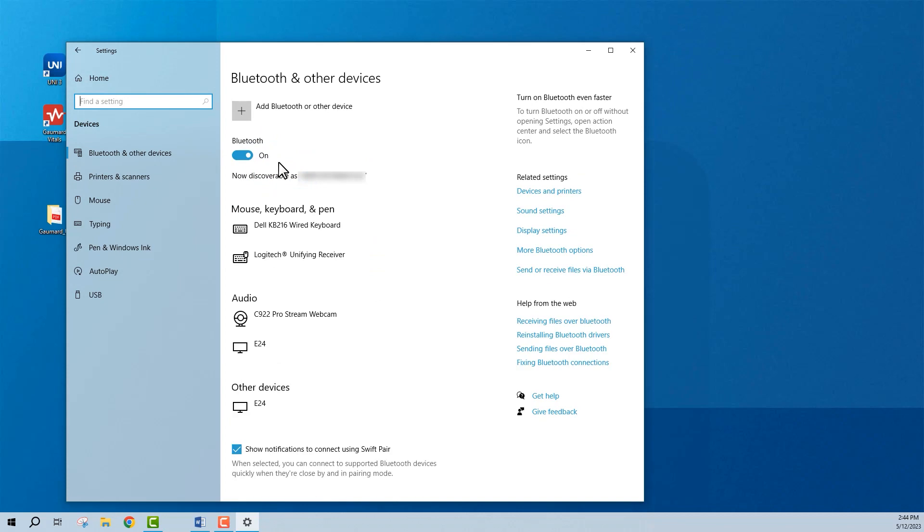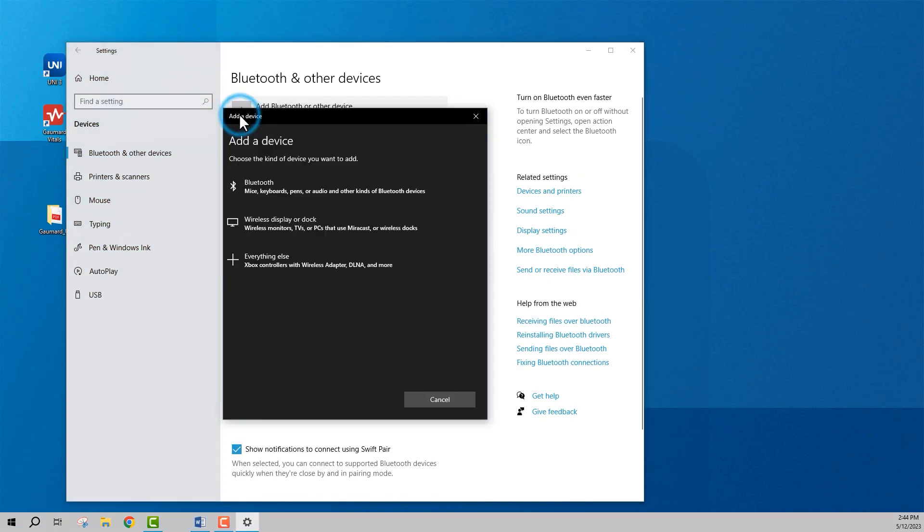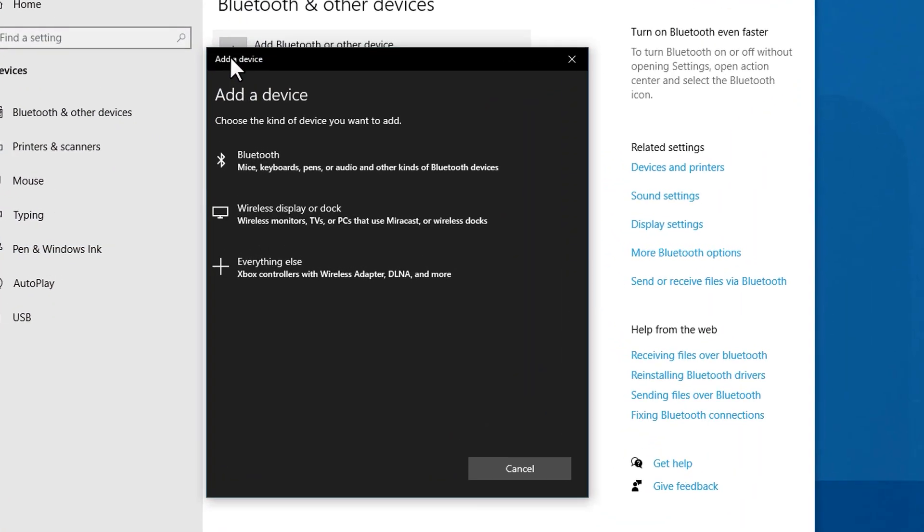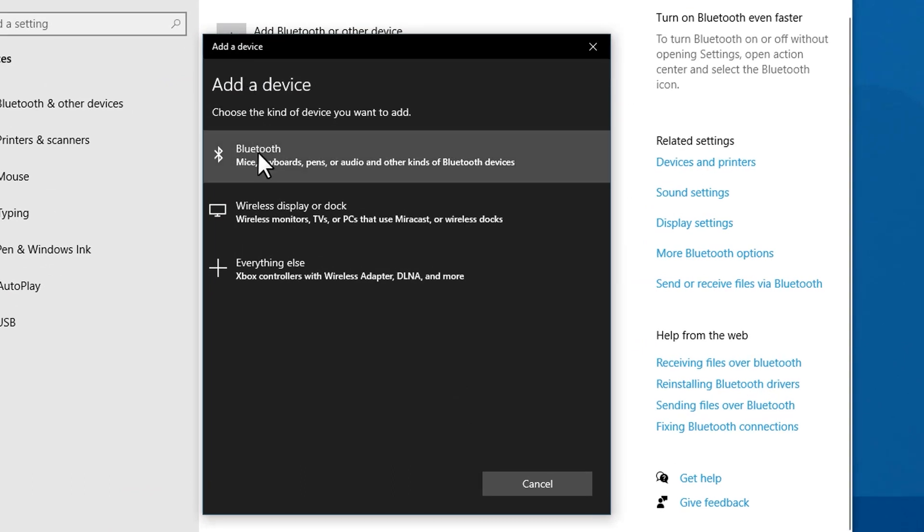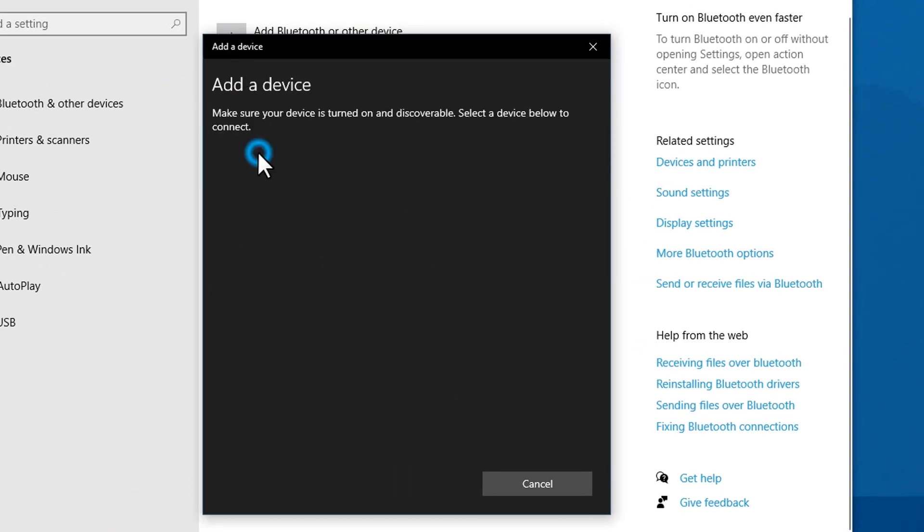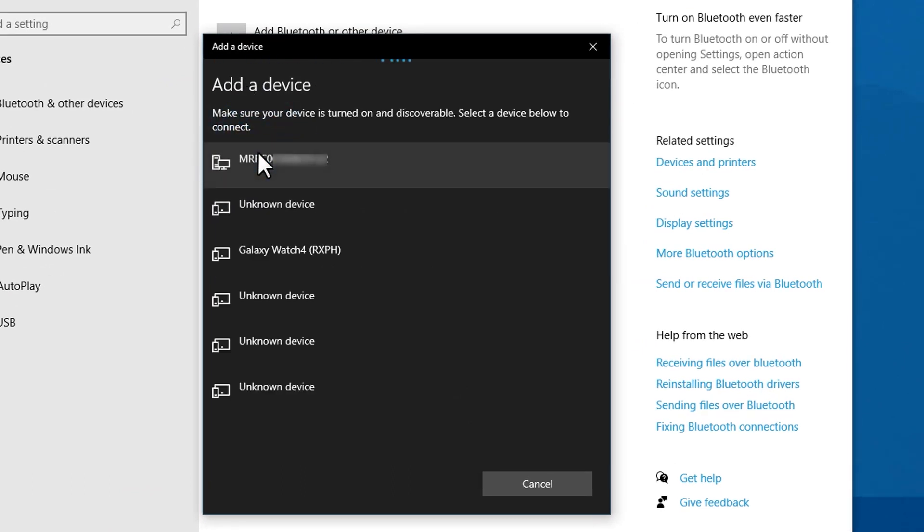And click Add Bluetooth or Other Device. Finally, click Bluetooth, and your computer will look for other devices.